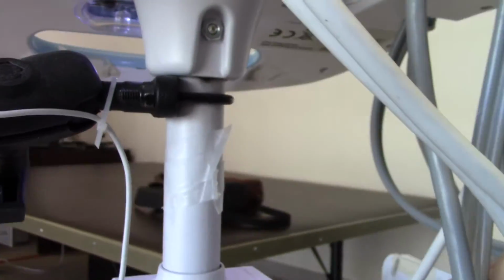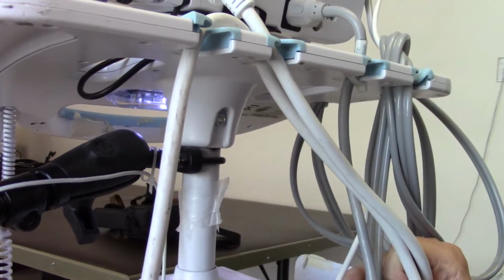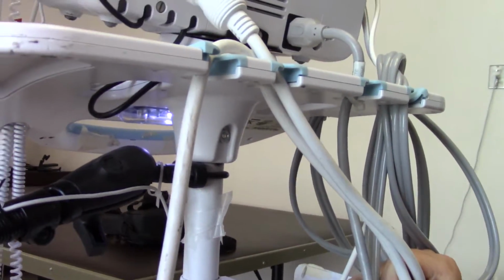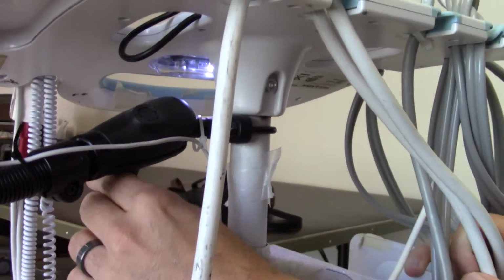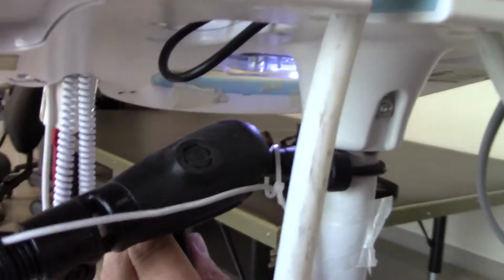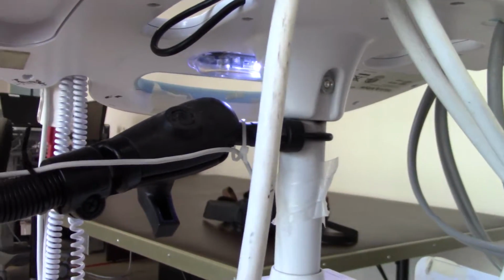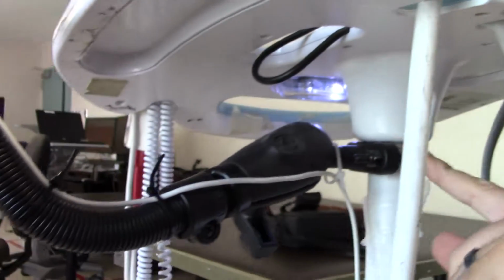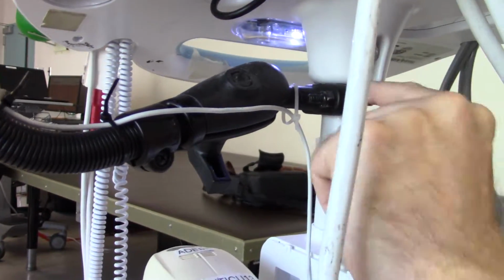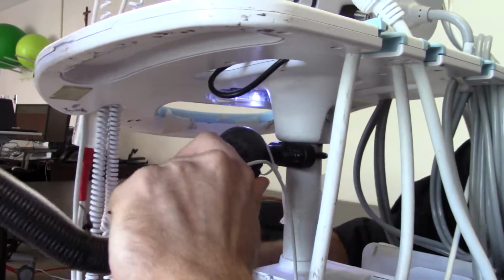The particular bracket we use goes up to 1.25 inches. It's just got a little U bracket that bolts on. Yep, a standard U-bolt, and then it goes to the mount. This company is RAM Mounts that makes this part, and you can buy all these devices. We just buy them right off the shelf. Now is this whole thing a single piece that you buy together? So this is 4 different parts that you're looking at here. So this mounting bolt, the U-bolt with this ball mount here. Yeah. And I can even take this off so you can see how this mounts on here.